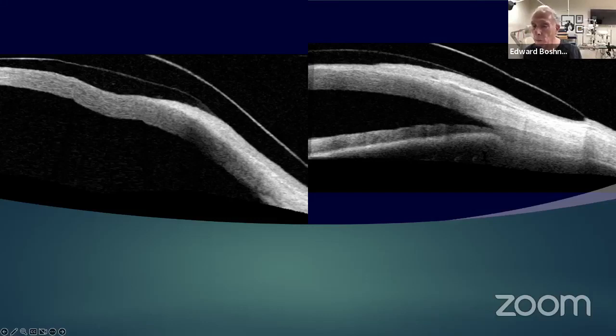I let the lab determine the diameter based on the images, but they usually are 17.5 millimeter. Once in a while 18, but that's usually it. As far as central thickness, I don't tell the laboratory about central thickness. I don't measure it, and I don't ask them. Maybe I should, but I don't. It just works out well. Let them do it.